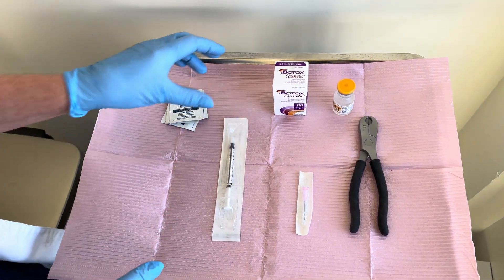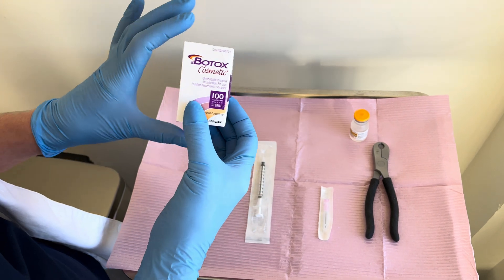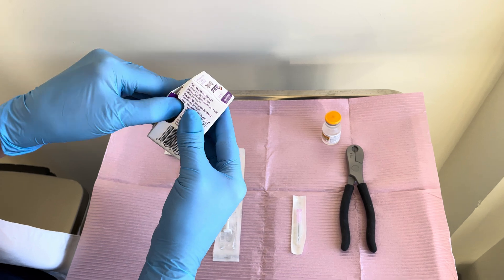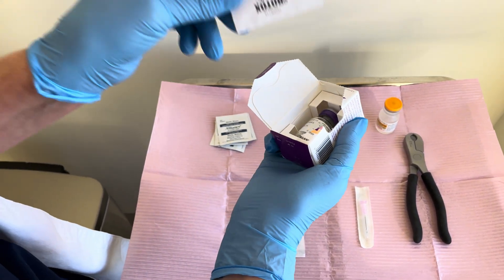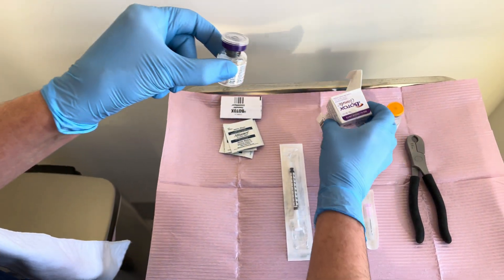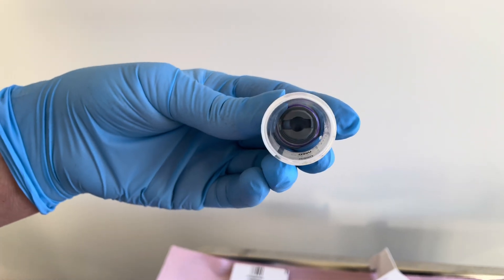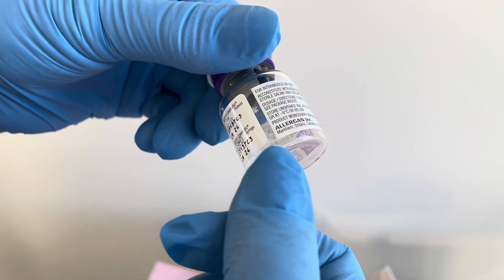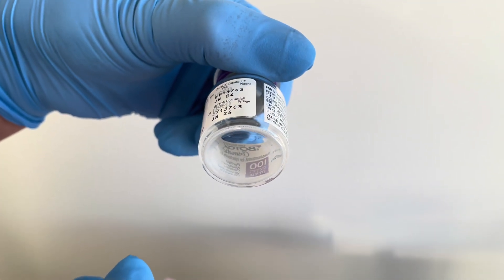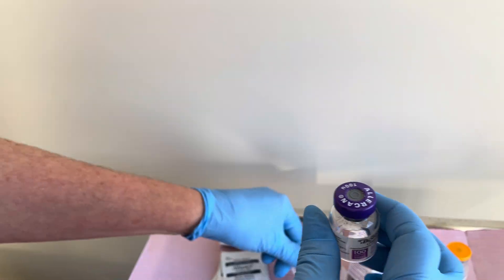I'm going to show you how to mix up your neurotoxin. There are four different types we're going to use — Botox today. The package insert is in here, which is always important to have, and make sure that you read that. This is your neurotoxin. You can see at the bottom it doesn't look like there's anything in it because it's a freeze-dried concentrate — there's a little bit of white film — but this is a full vial that has 100 units of neurotoxin. You're going to take off the cap, which just comes off.